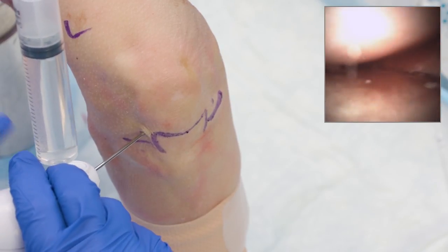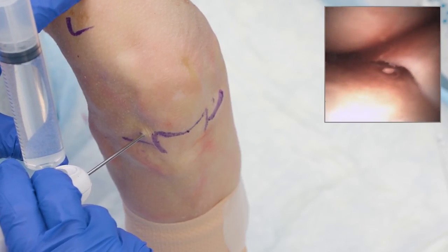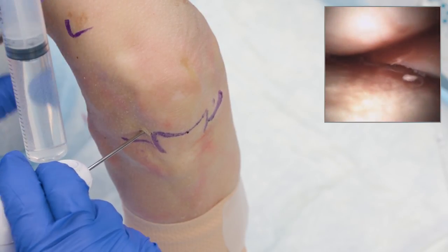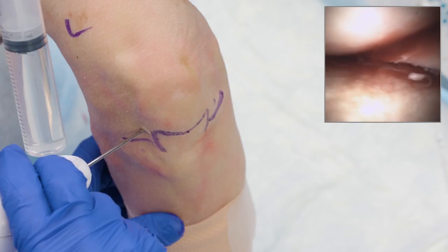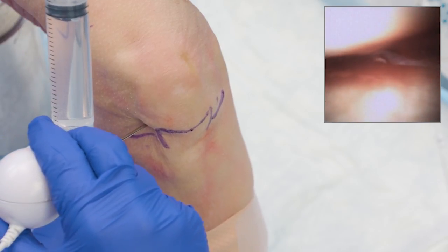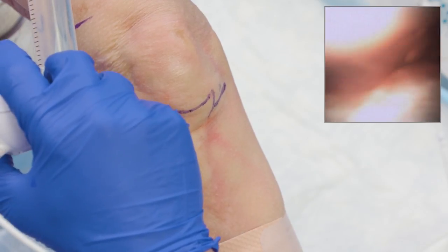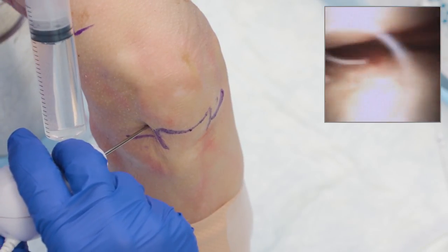Once inside the knee joint from the medial side, I can begin a diagnostic evaluation of the medial meniscus. Here we're seeing the mid-body of the horn — the femoral condyle is visible up top and the tibial plateau below. I'll give a little flush to clear the view and get rid of synovial tissue, then evaluate cartilage on both sides. To get to the posterior horn, I drive right toward the small dark triangle or space, then sweep around to see the horn. Movement of the knee from flexion to extension creates more visualization. By extending the knee, I can get underneath the femoral condyle. A little flush clears synovial fluid from the way.